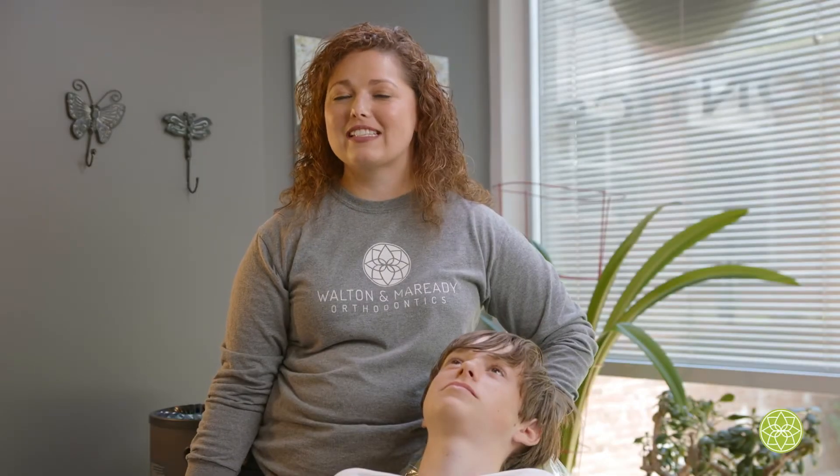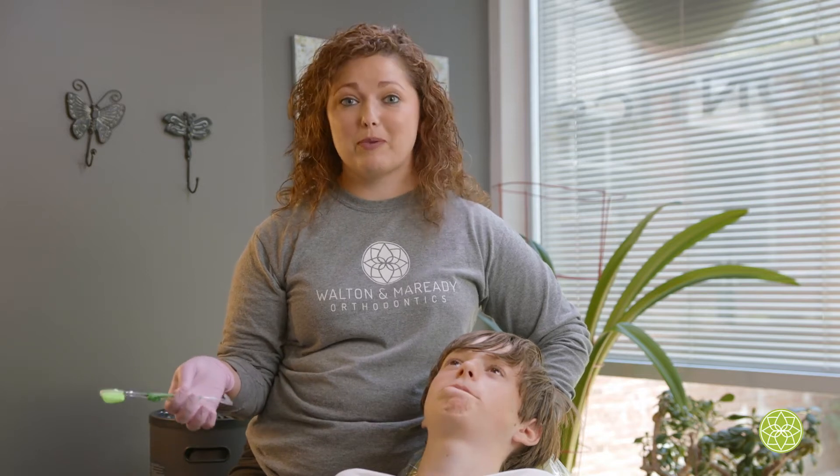Hey everybody, my name is Lauren. I'm an assistant here at Walton M. Rady Orthodontics and I'm going to show you the proper way to brush your teeth with braces.